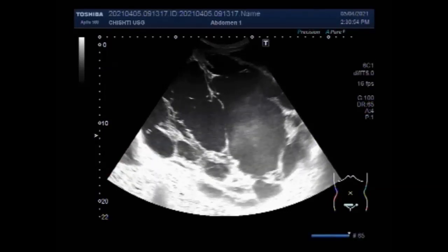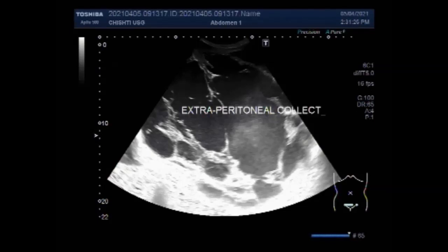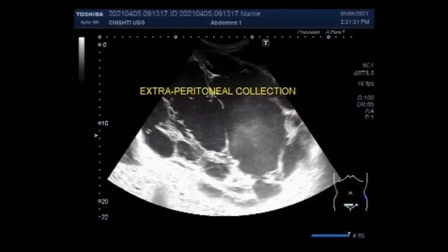The peritoneal cavity contains the omentum, ligaments, and mesentery. Intraperitoneal organs include the stomach, spleen, liver, first and fourth parts of the duodenum, jejunum, ileum, and transverse and sigmoid colon. This large collection measures about 26 cm × 21 cm — quite a large collection — and has multiple septa.